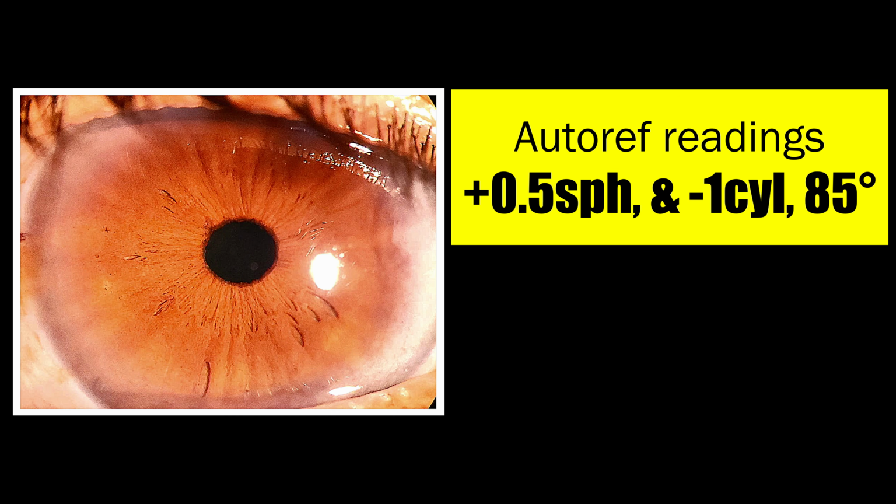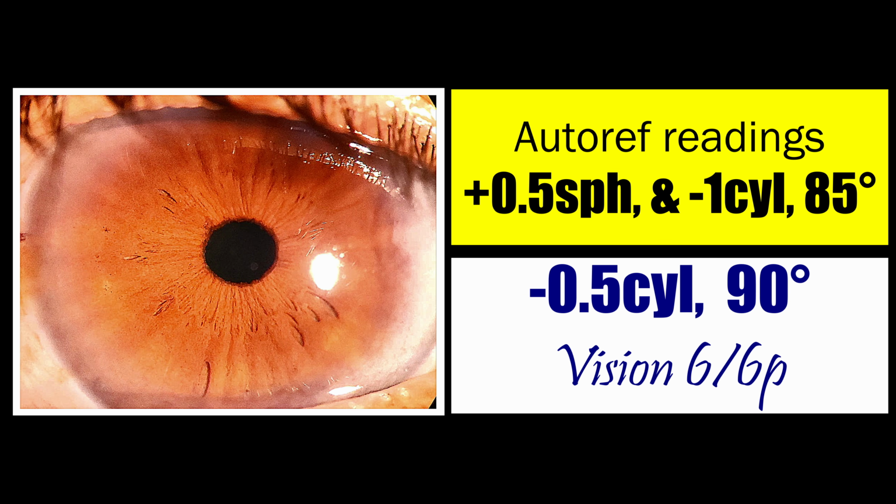And the autoref reading shows plus 0.5 spherical and minus 1 cylinder, 85 degrees. And she accepts about minus 0.5 cylinder, 90 degrees. And she reads 6/6. So this was quite a good outcome in this eye. Although there is a minus 0.5 cylinder residual, well, it's okay.